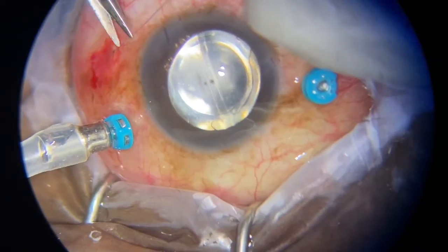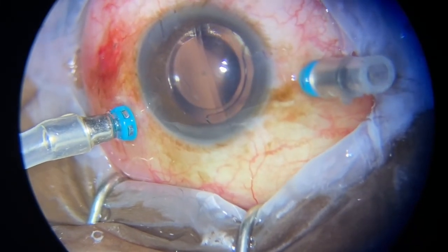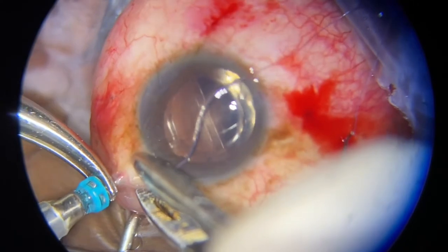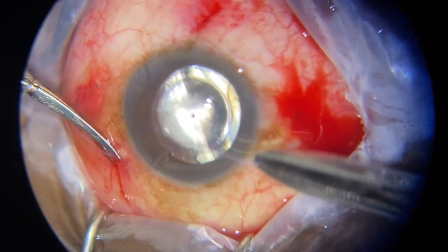Because the retinotomy is posterior, face-down for a few hours is just enough for it to work. Whilst my assistant pumps in the C3F8, I put a vent to flush out all the air. Almost getting to the end — we close all the sclerotomies and whatever gas is left, we top off by injecting it into the eye.